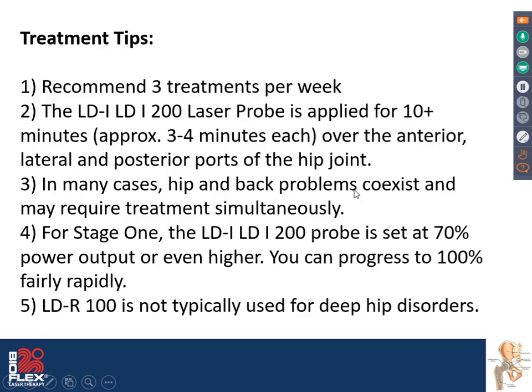We don't usually use the red probe for hip joint disorders, just given the depth of the condition. The red light's not really going to be penetrating very deep, and the pain is really located really deep. So it's not overly effective for the hip joint.